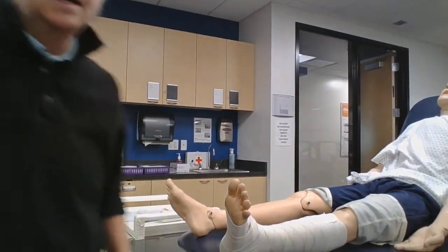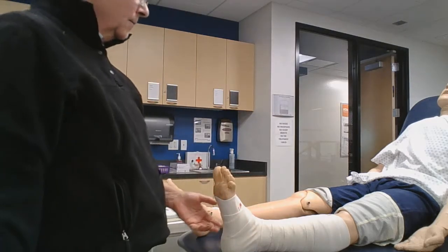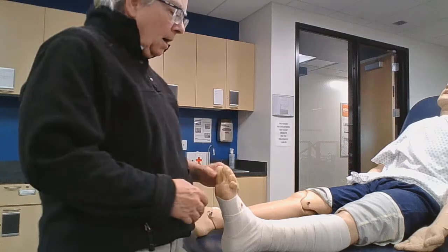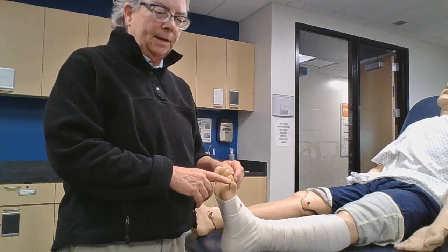So the one thing I did want to say is we're going to finish this up with Joe and tell Joe, so how does that feel, Joe? And of course, all the way along the way, we should be asking Joe how it feels. And then we want to check digits, okay? If there's too much compression, toes are going to go purple or white.